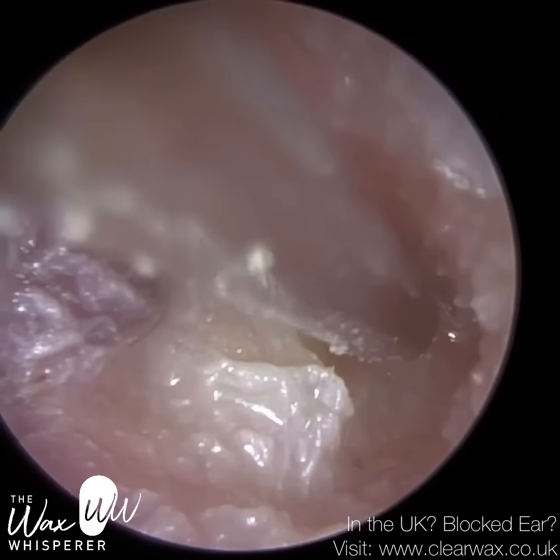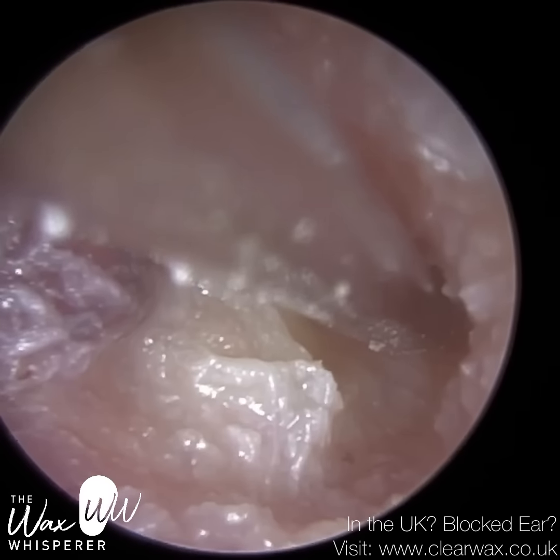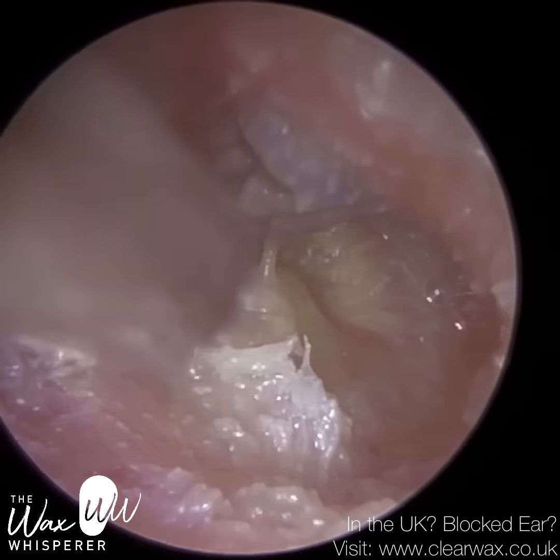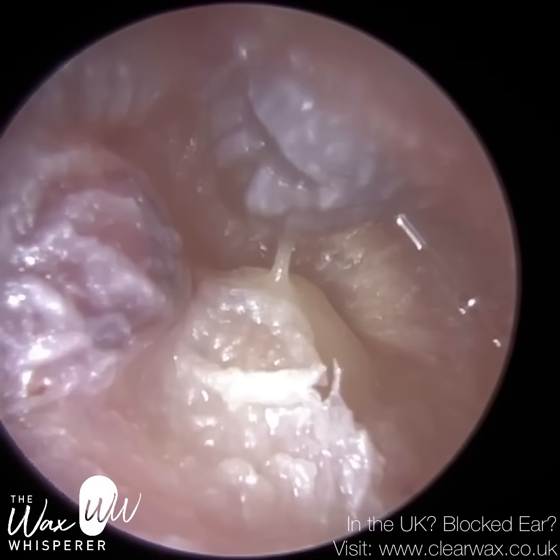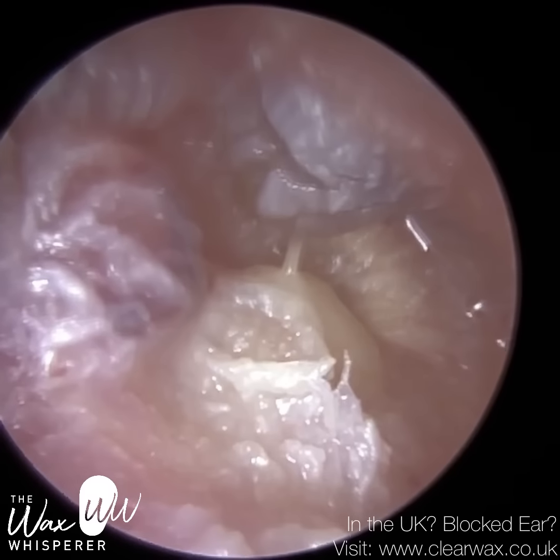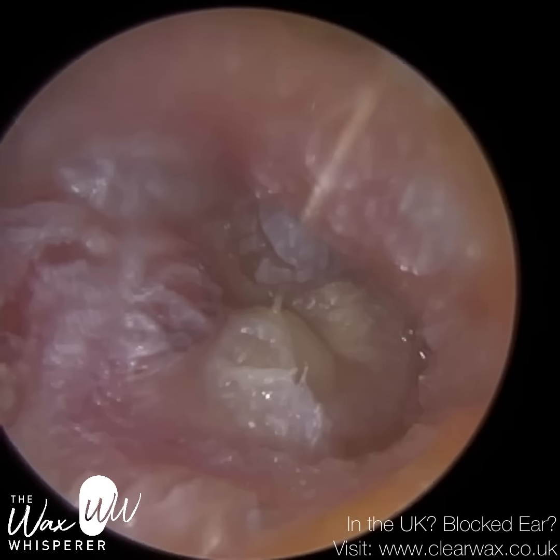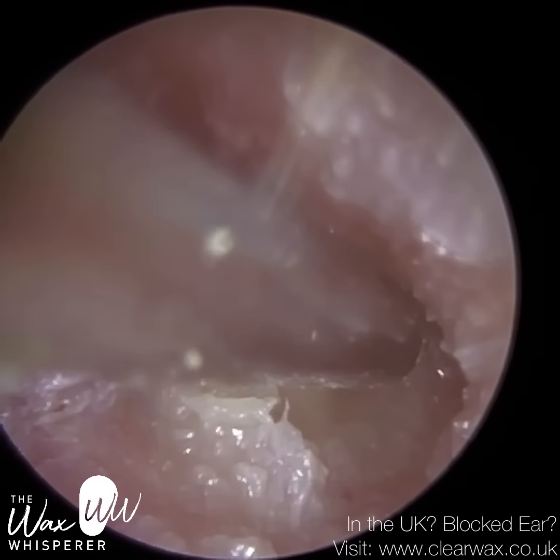I'm just working on the eardrum now, and you can see it's extremely bulged. There is some discharge here, so I was wondering whether there was a perforation, but I couldn't see one. The giveaway sign that there's no perforation, and you'll see it in a moment, is that centrally there's a big bulge there. You can see it beating. So this patient has got fluid, the glue ear, behind the eardrum, and it's causing the eardrum to inflame and bulge. And it's possible that if this is not resolved, this patient's right eardrum can perforate, it can explode, it can burst open, it can pop, because it's too much fluid.